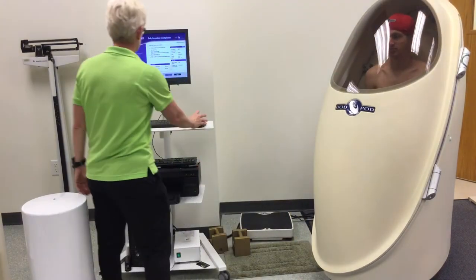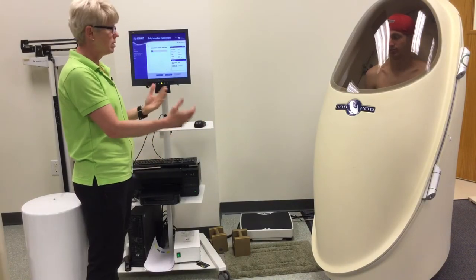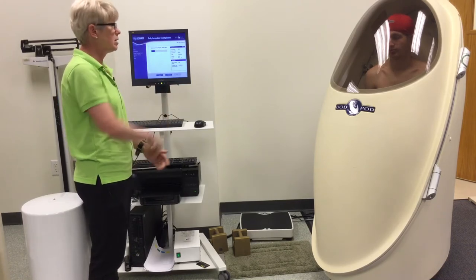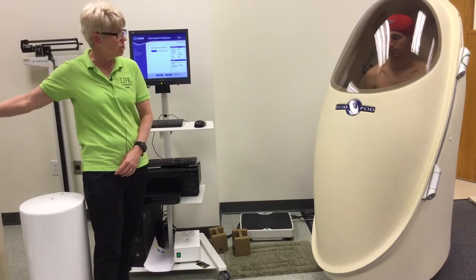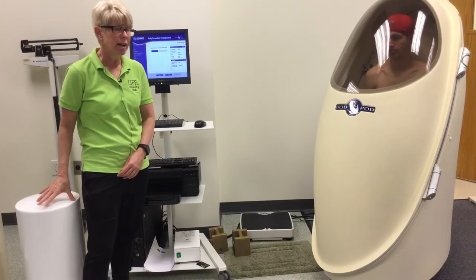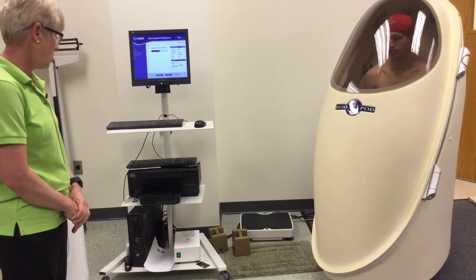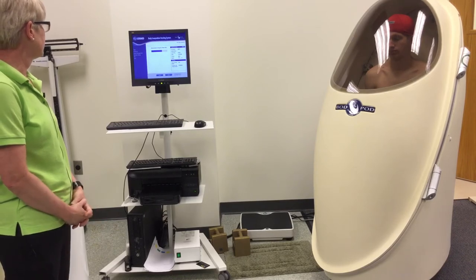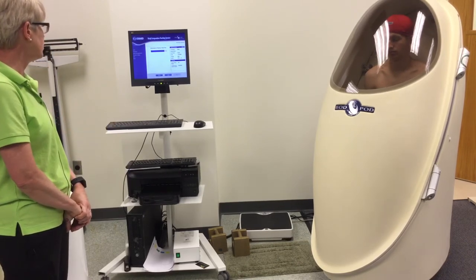They just sit in there and breathe normally while the bod pod system moves air in and out for air displacement. This is based on air displacement, whereas over here to my right is the hydrostatic tank, and that system is based on water displacement. Now it's going to do a series of measurements, and it'll ask me to open the door and close the door a couple times, which you'll get to see the full test here.